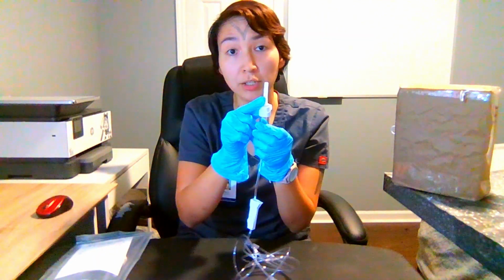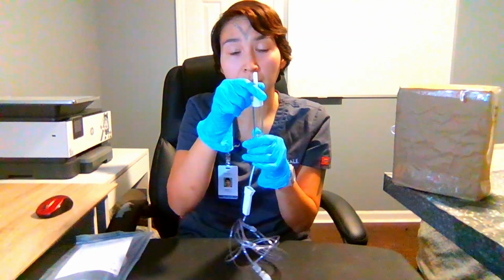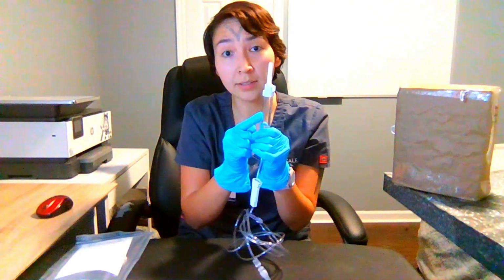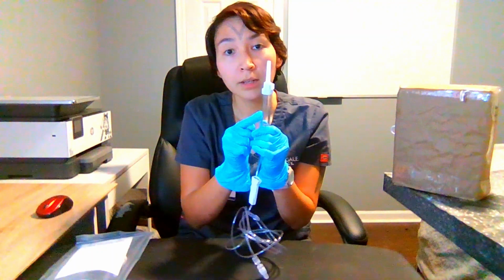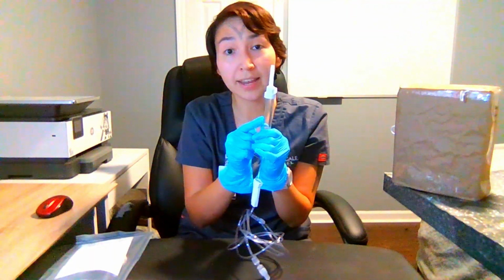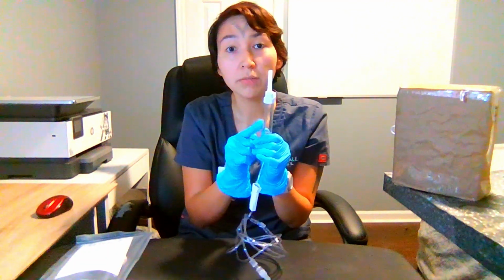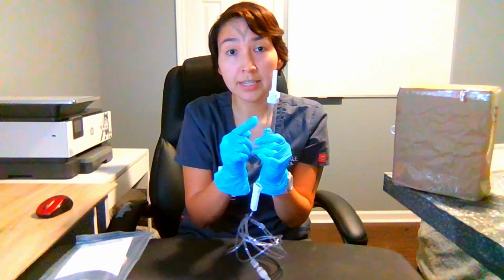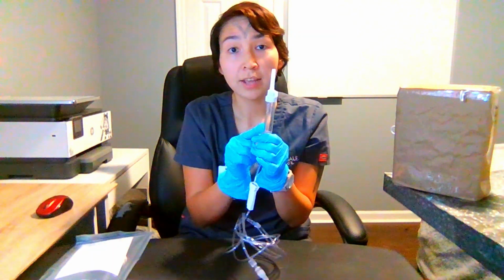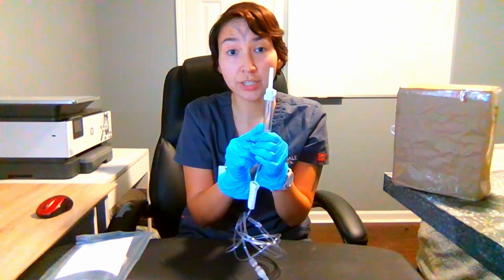The components are the spike end. This connects the tubing to the fluid bag. A drip chamber, the site where the rate is counted. It delivers small volumes with the aid of gravity. A small volume of IV solution is placed in the chamber and regulated for administration.